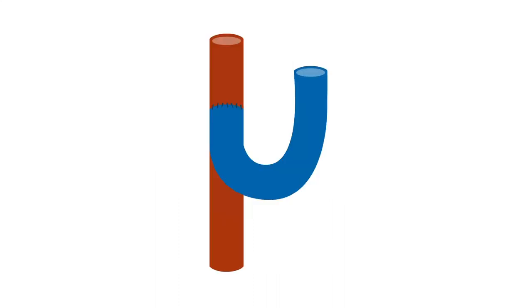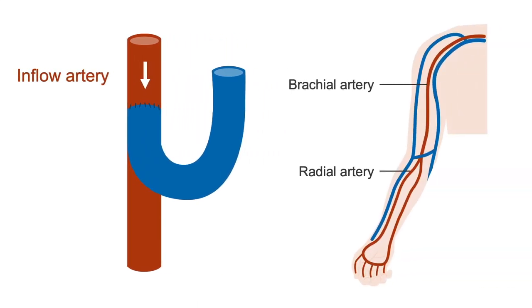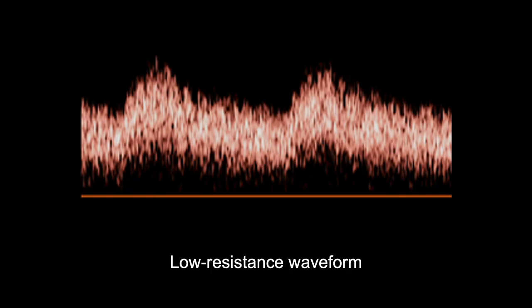Next, waveforms are obtained from the inflow artery, so either the brachial or the radial artery, approximately 2 cm proximal to the anastomosis. Remember that if the fistula is patent, the inflow artery waveforms will be low resistance, meaning there is flow during diastole.